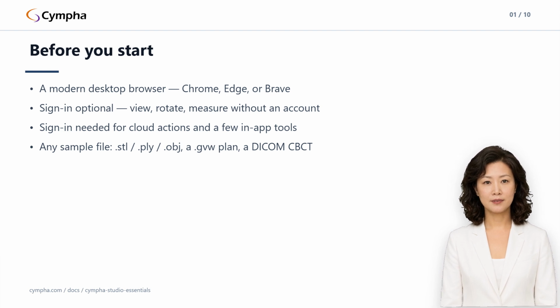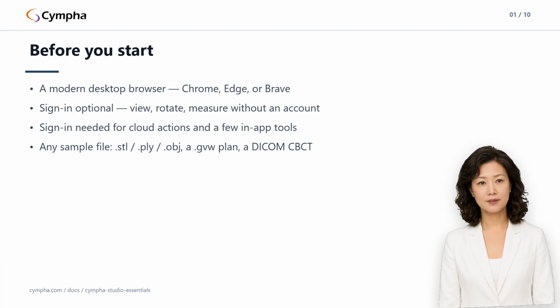Second, a Cympha account. Optional, but recommended. Studio opens and renders with no sign-in. Drop in a scan from disk and explore and measure freely. Sign-in is needed for cloud actions, creating a Cympha case, opening a case shared with you, saving back to the cloud, and for a few in-app actions: saving a cephalometric tracing to the gallery, the area touch-up and remove region cleanups, and the Smile Design PNG download.